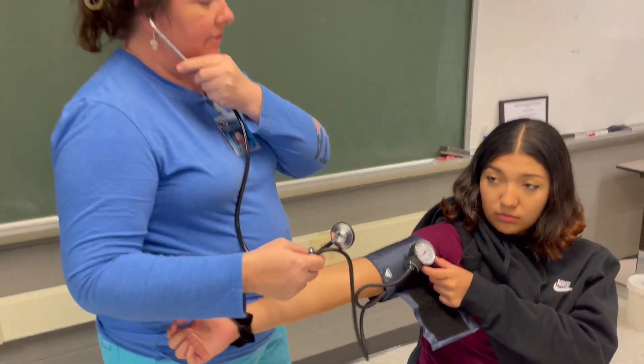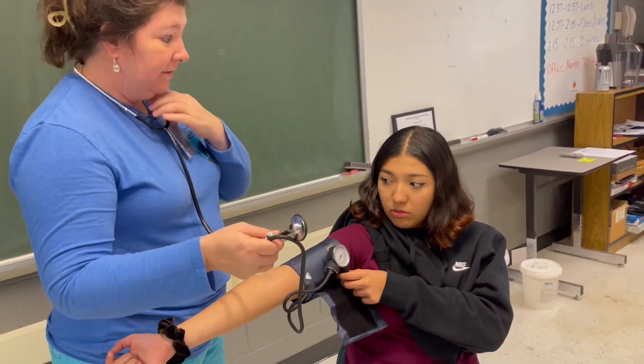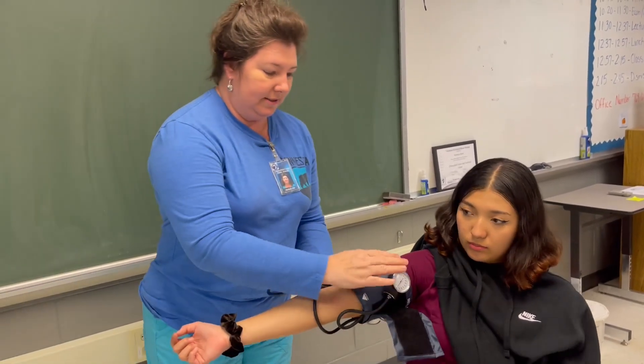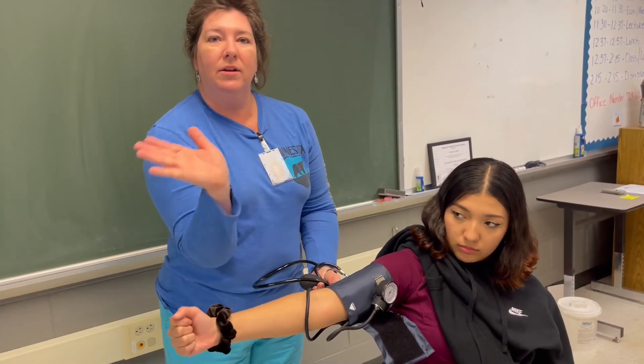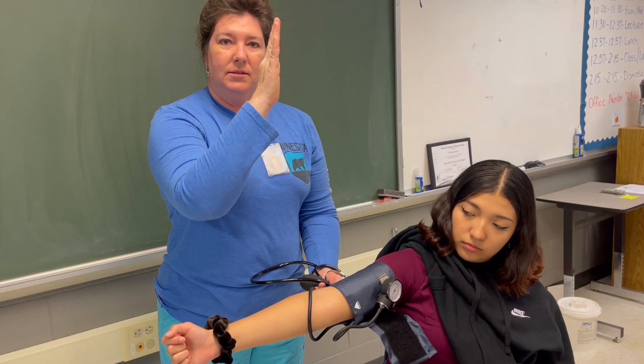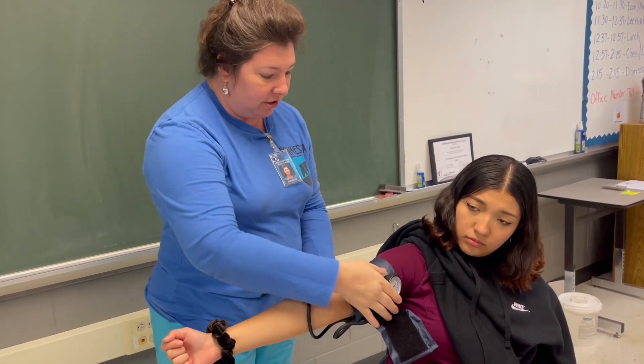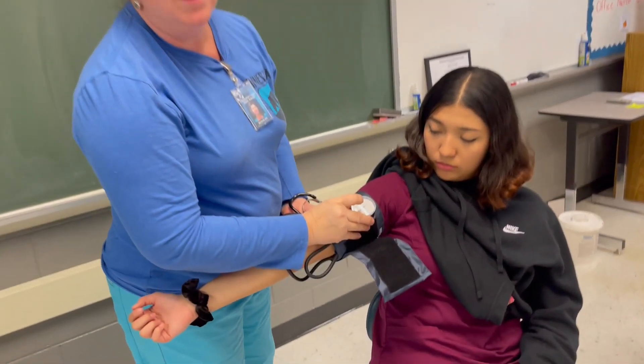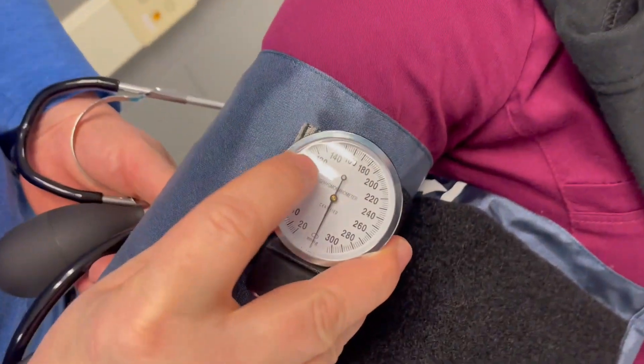Okay. Now, how did that feel? It was fine. Fine? Okay. So, what I heard was when this dial went bump. I heard that first bump at about 110. 110.